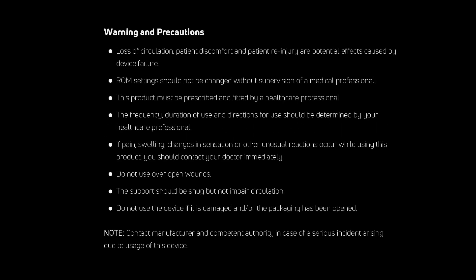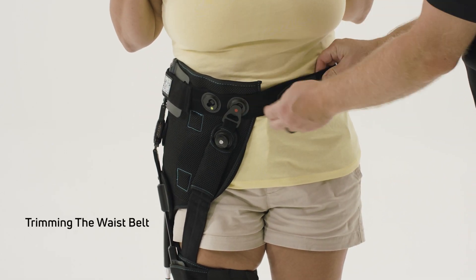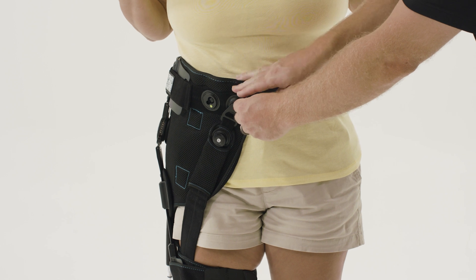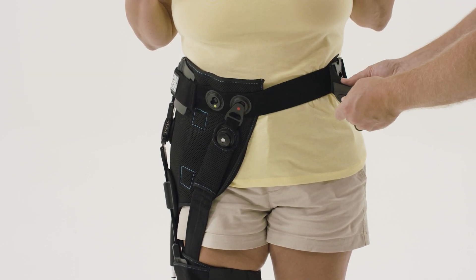This video focuses on tips and tricks to facilitate patient fitting. First, instruct the patient on how to trim the waist belt, as the brace is usually fit to accommodate swelling and fluid retention common immediately following surgery. Most patients will prefer the belt tighter over time.